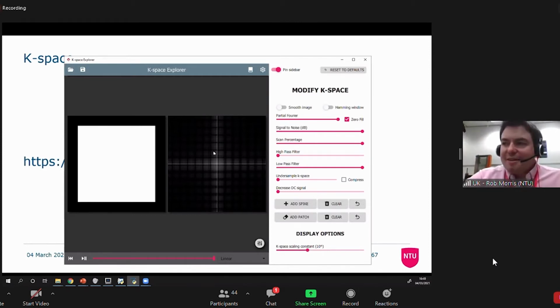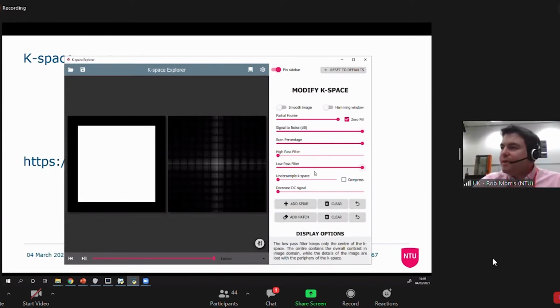The thing then which is interesting with K-space, I do know a couple of people actually that can tell you what objects are based on looking only at their K-space. I am not one of those people. But if you think about what's happening here, in the middle are signals where we've got things that have experienced no change in phase. That's our kind of big bulk parts of the signal. And what that means is, if we, let's see if I can find the right one here.